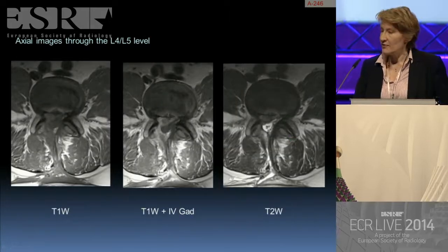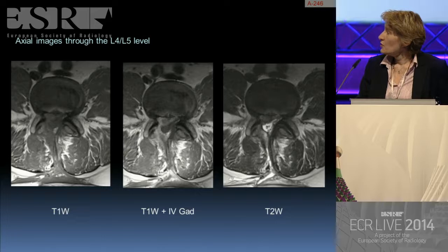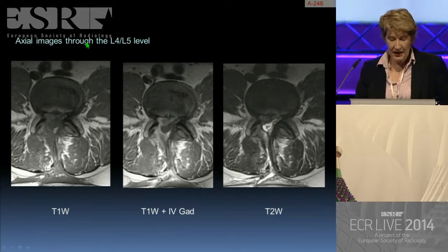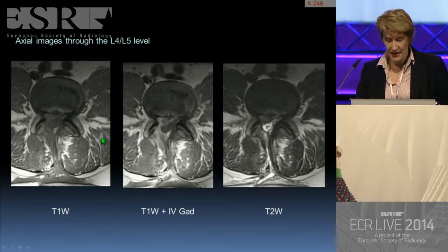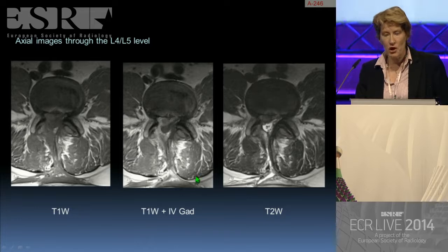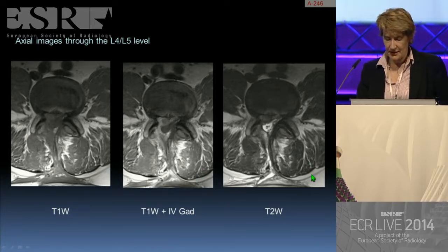These are axial images through the L4-L5 level: the T1-weighted study, the T1-weighted post-contrast study, and the T2-weighted study.